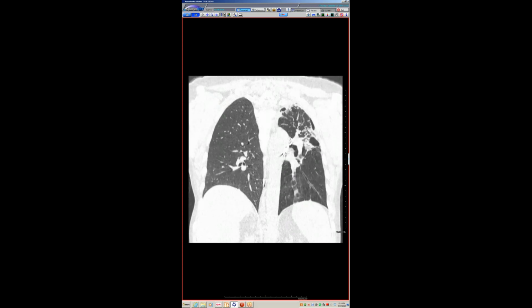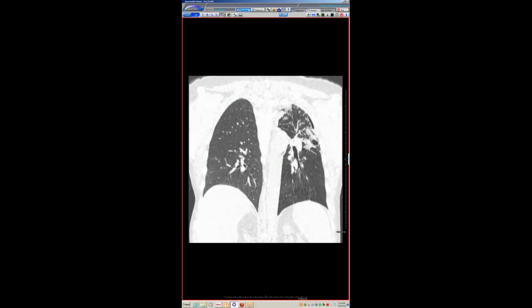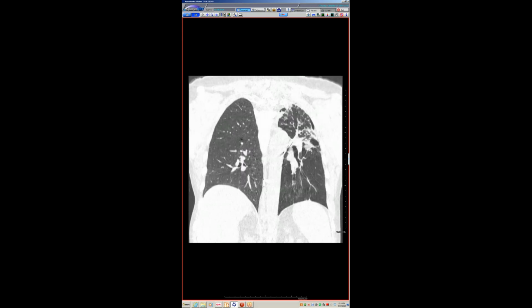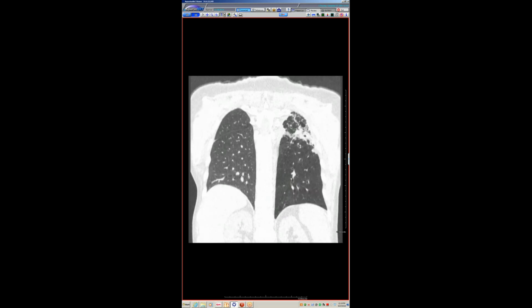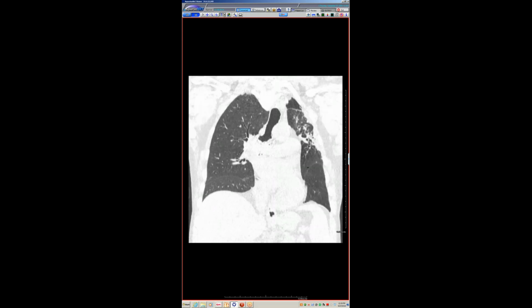So my question to you guys is, what do you think is actually going on in the left upper lobe, and what was presumably the same process happening in the right upper lobe before transplant, because all the path report says is recurrent LAM and fibrosis. They said specifically there's no evidence of rejection, which is odd. On the left, this is now 17 years after transplant. This is the initial transplant. We have obliterative bronchiolitis in the left lower lobe and lingula.